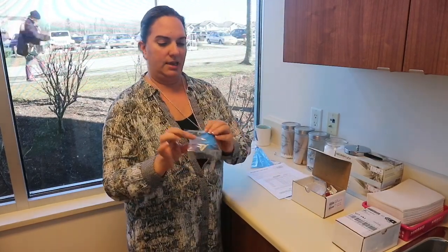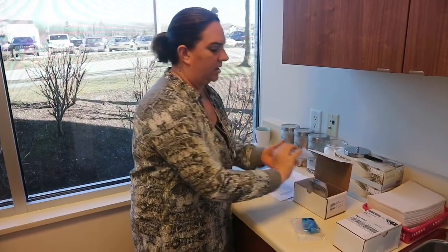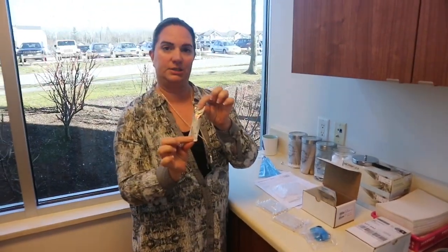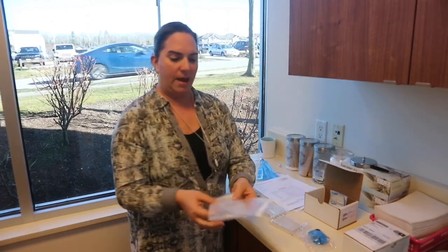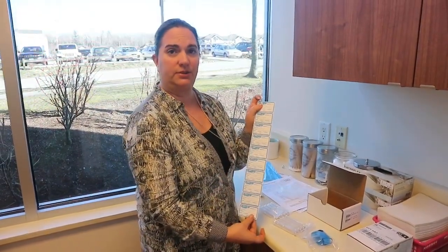There will also be your breath tubes — ten of them — lactulose, bubble wrap to put your tubes into when you've finished your test, and then ten labels for your test tubes.